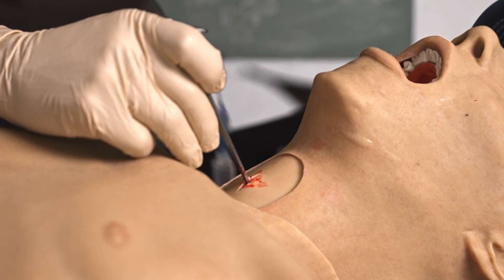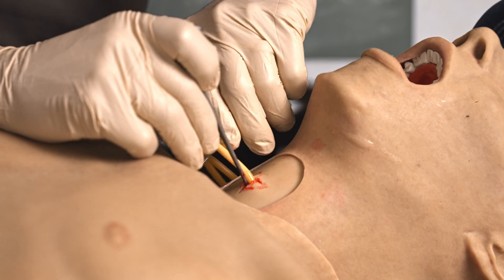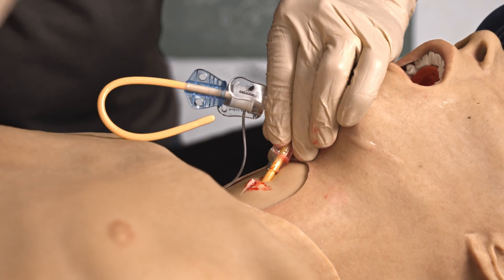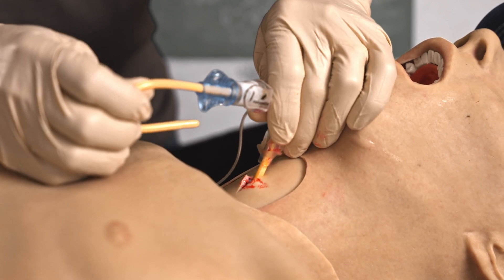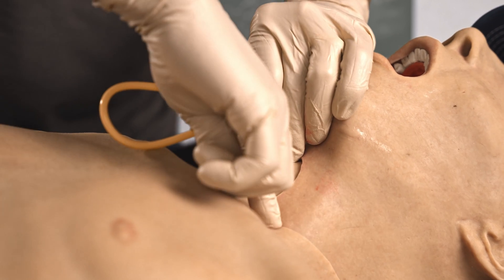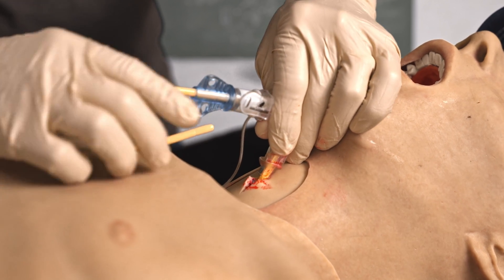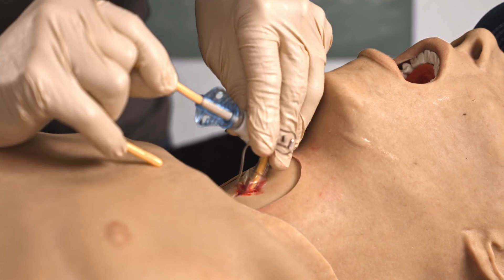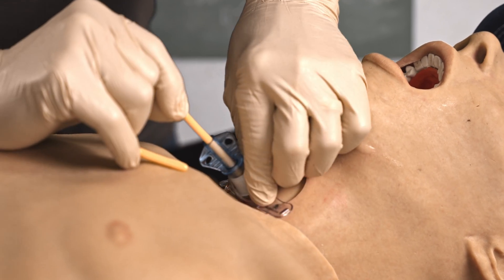Next, I'll take the bougie end of my cricothyroidotomy kit and place that bougie inside the trachea. I remove my cricook since I'm inside now. I feel free motion going in and out of the trachea, and I don't see any tenting of skin on either side of the neck — which would indicate I'm not in the trachea and am going out through skin. Once I'm sure the bougie is in place, I glide the cricothyroid tube over it until it's seated.